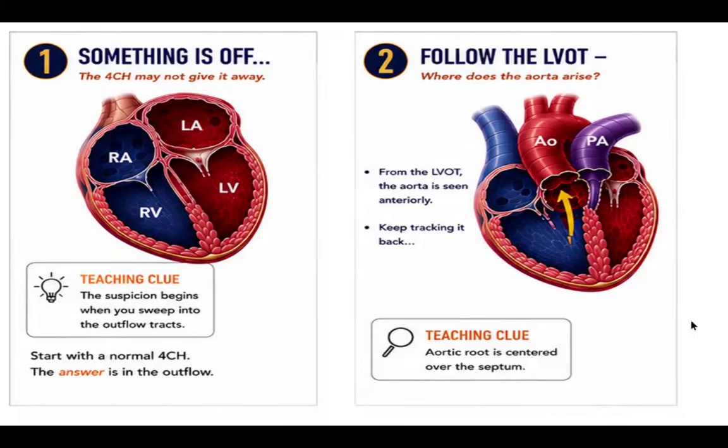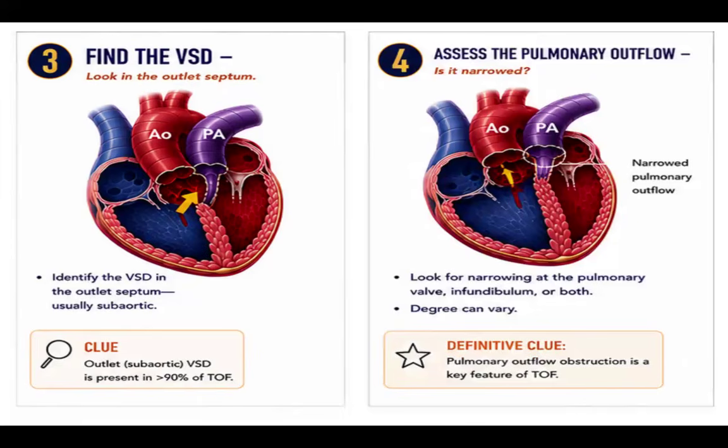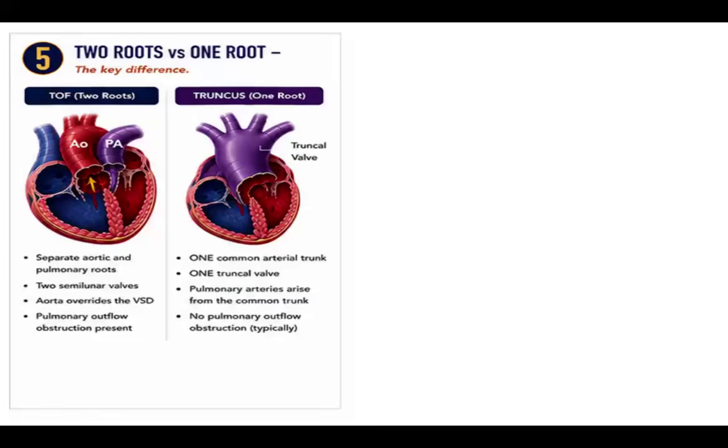What is going on? Oh, there's a VSD, which I believe is step three. Step three, that's when we notice that VSD. Okay, outlet, things are happening. And then from there, we're looking at that pulmonary, where we notice that there is some stenosis or narrowing of the pulmonary artery. And so you take a step further, you measure, you apply your color Doppler, you even sample just to hear if there's any changes from normal. Okay.